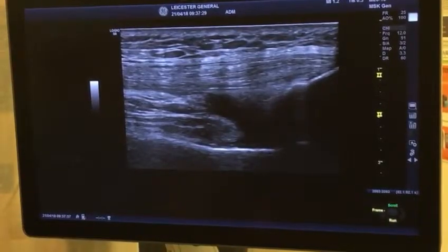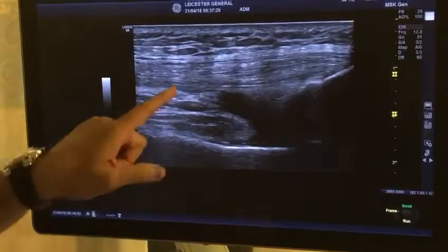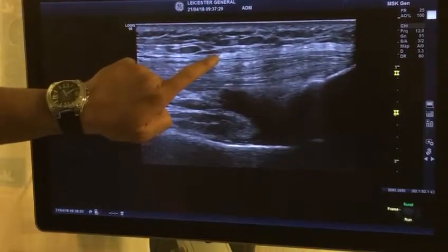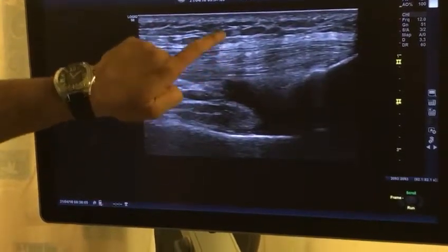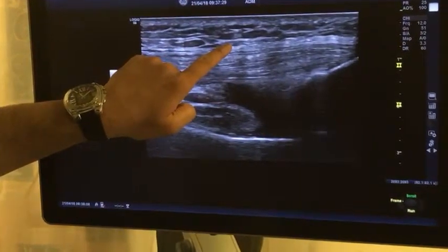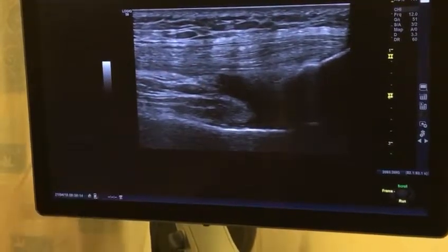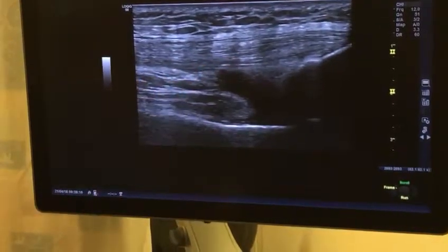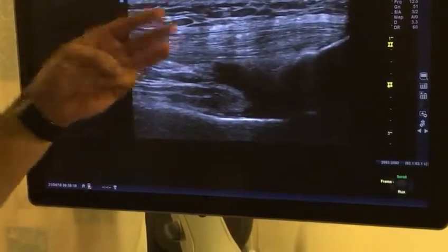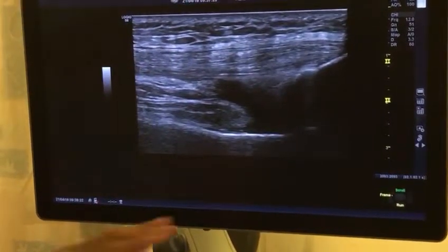That's where the fluid is — fluid looks black on the ultrasound. Everybody will have some fluid. Now you've got three layers: one, two, three. The top layer is your rectus femoris, the middle layer is your vastus medialis and lateralis together, and the bottom layer is your vastus intermedius. That's your quadricep tendon.